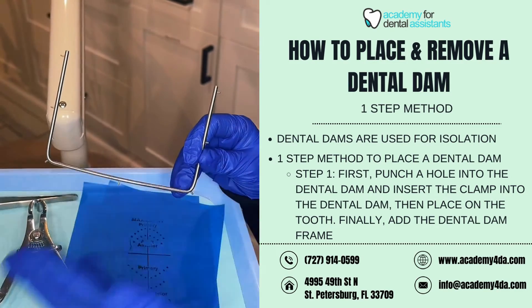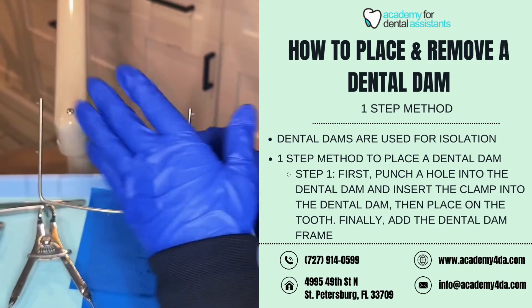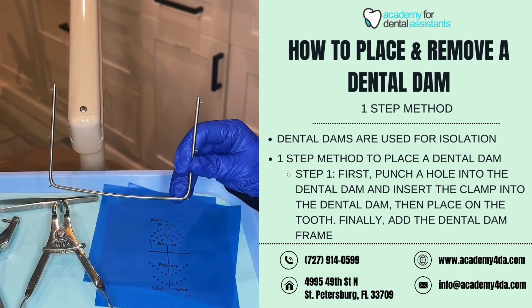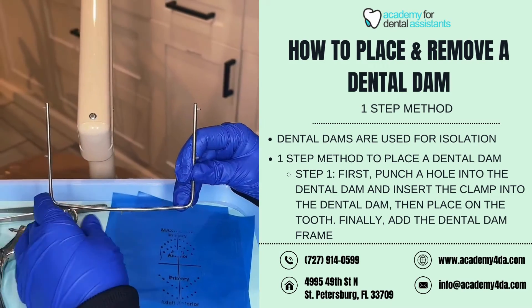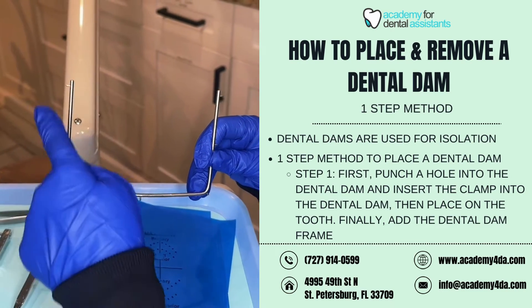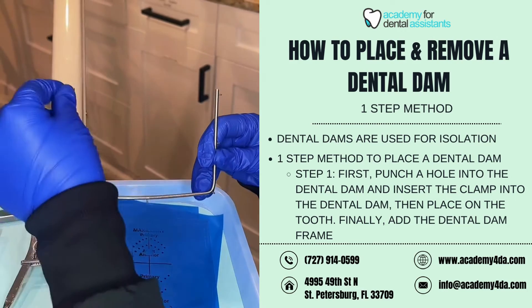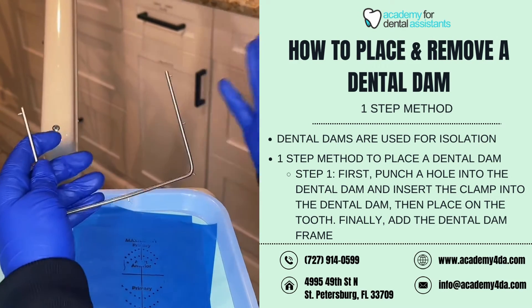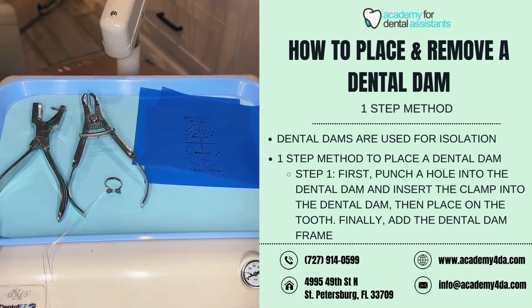This here is our dental dam frame. Our dental dam frame has an open end and a closed end, almost like a field goal post. The open end will go more towards the top of the head, whereas the closed portion will go more towards the chin. The projections that come off the sides of the frame are what we use to wrap and stretch the dental dam to create isolation in the mouth.